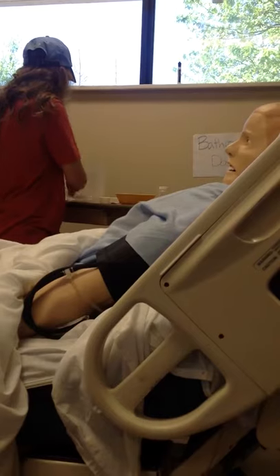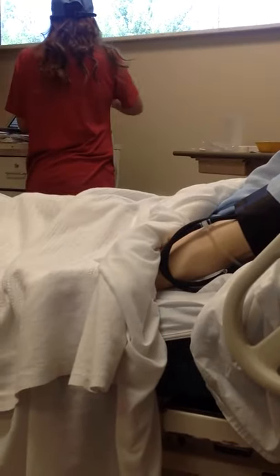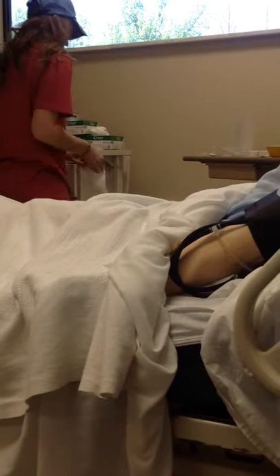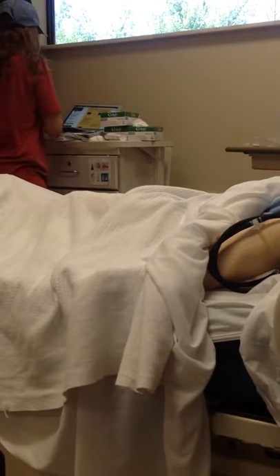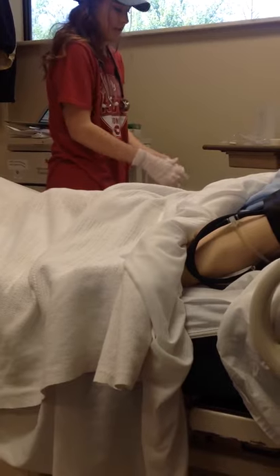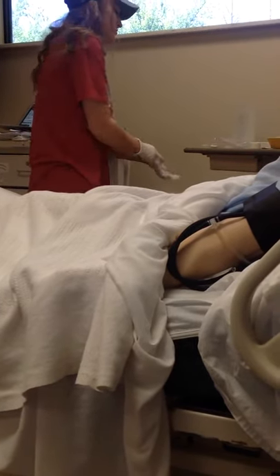So first, I'm going to perform hand hygiene again and put on some gloves. We got an order to put in a nasogastric tube and administer 60 mils of food. And first, we're going to check the pH to make sure it's in the stomach, and then we're going to send you off to get an X-ray, just to be sure.